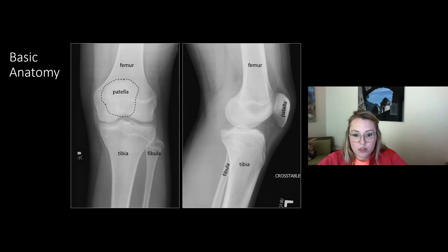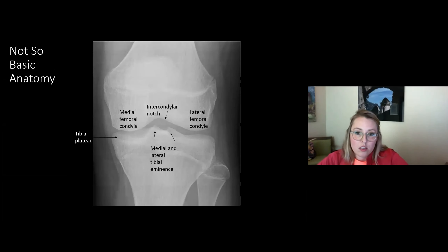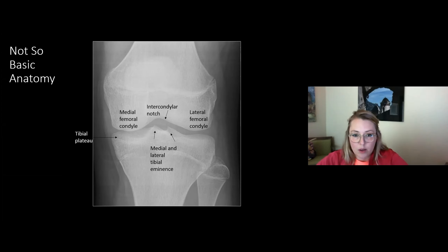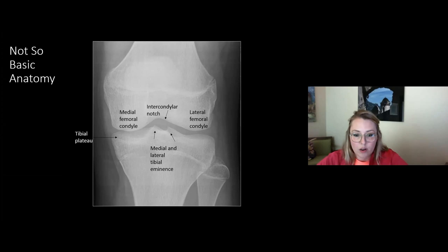On the AP view we have the femur, tibia, and fibula, with the patella sitting in its characteristic location. The fibula helps locate the lateral side of the knee — the lateral femoral condyle — and then we come into the intercondylar notch and the medial femoral condyle. The oval-shaped tibial plateau sits below, with the tibial eminence or tibial spines — that little mountain range in the middle — serving as important landmarks on radiographic evaluation.